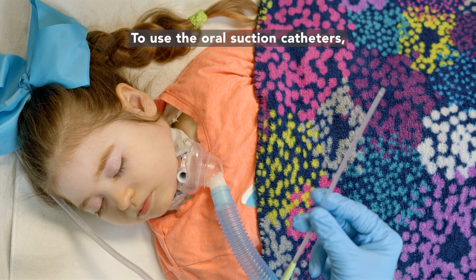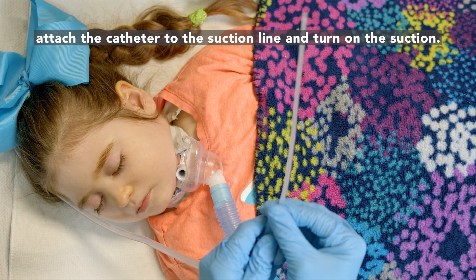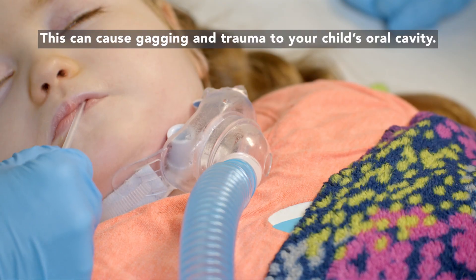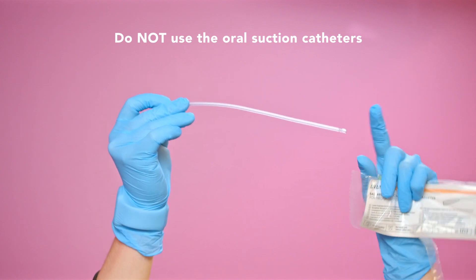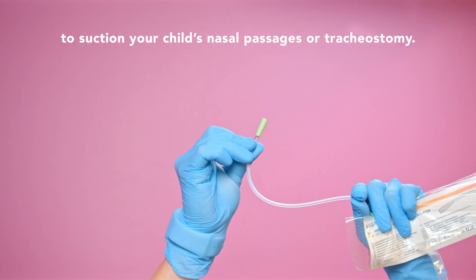To use the oral suction catheters, attach the catheter to the suction line and turn on the suction. Gently suction your child's mouth to remove secretions without going too deep. This can cause gagging and trauma to your child's oral cavity. Do not use the oral suction catheters to suction your child's nasal passages or tracheostomy.